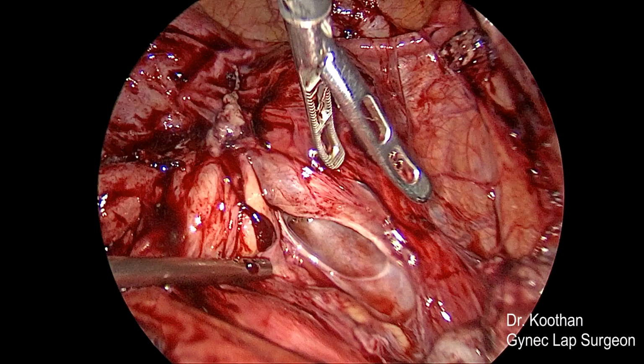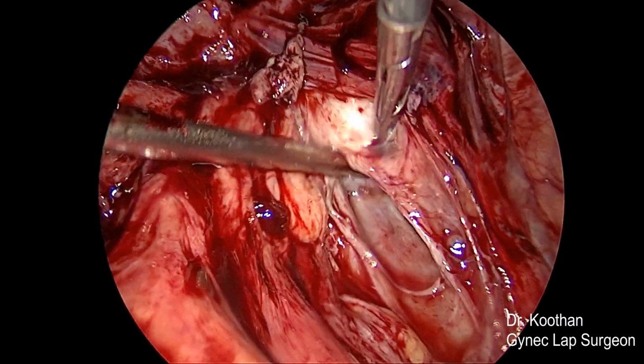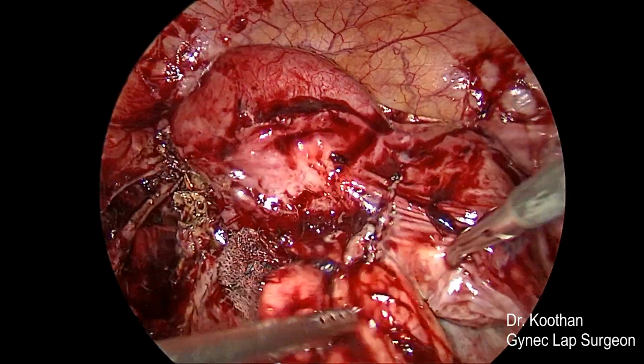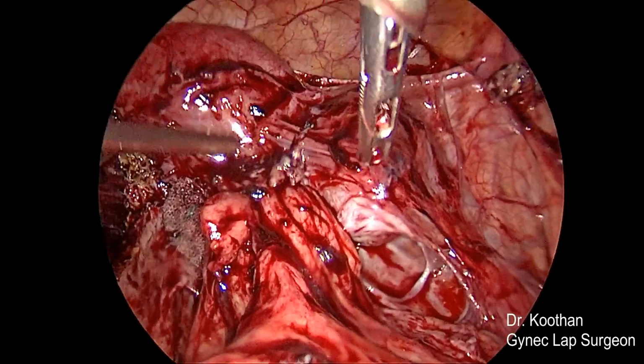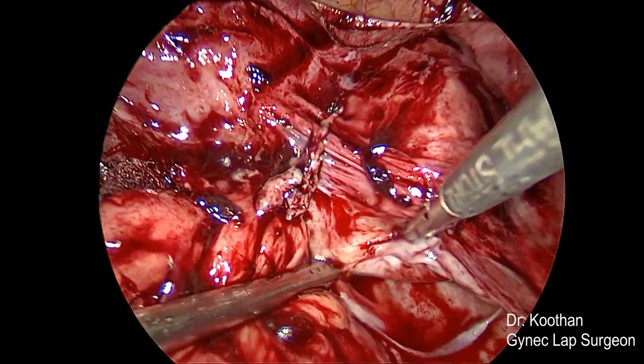Now we are separating the plane between the mesorectum and the Pyosalpinx. The Pyosalpinx is also densely adherent to the posterior pelvic wall. It is very densely adherent.